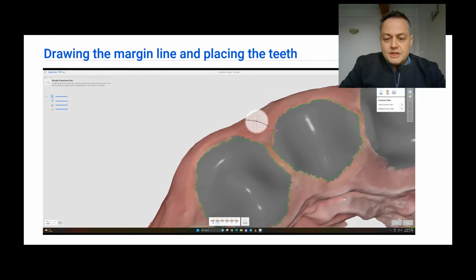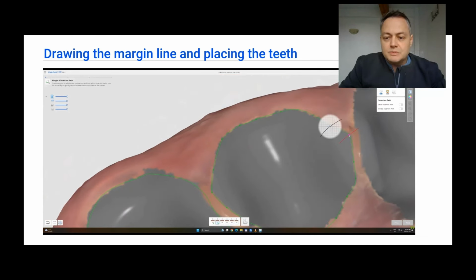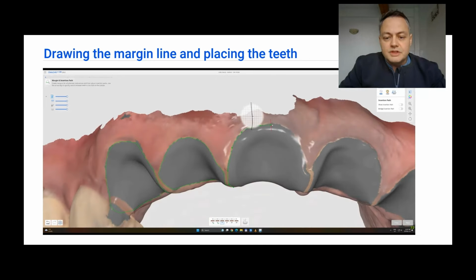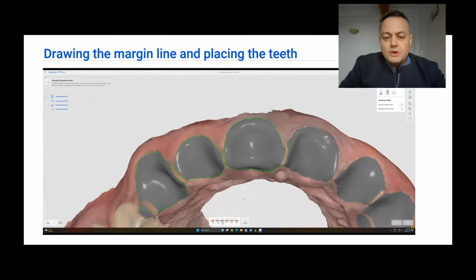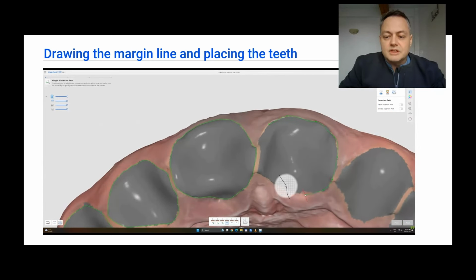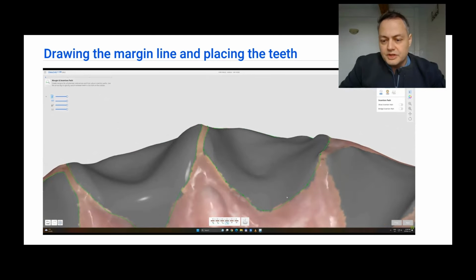because when generating the teeth, after placing the proper position of teeth from the Medit library, they are going to get pulled to this margin line that we are just placing now, and we want to have this margin line at the emergence of the actual real teeth. So this is also why when doing the virtual extraction techniques, we need to not modify the area that surrounds the gray spots. So always be careful how you manage this data, how you subtract and morph it.